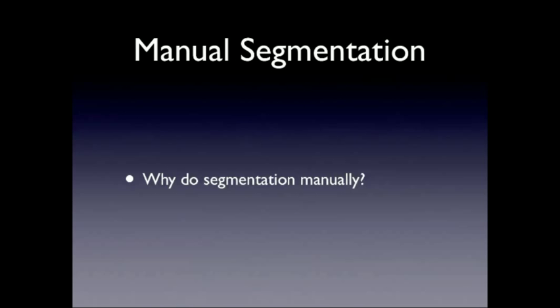So the obvious question is why do we want to bother with manual segmentation? A lot of you are probably familiar with some of the tools we have for automatically generating ROIs like PickAtlas or FreeSurfer, but for more difficult structures, more intricate structures, they're never going to be as accurate as a manual rater. And even if you're using any of these automatic methods, you need some way to prove that they're at least comparable to what a human rater could do.